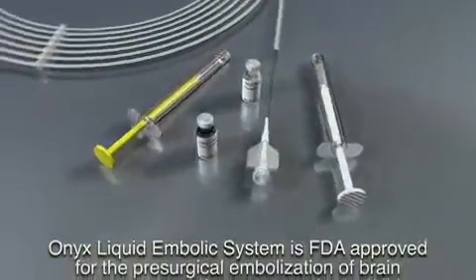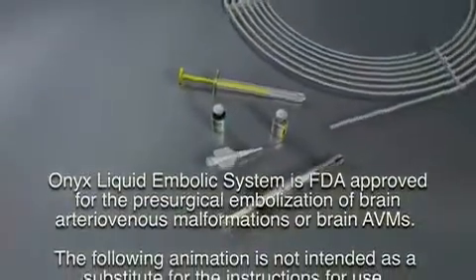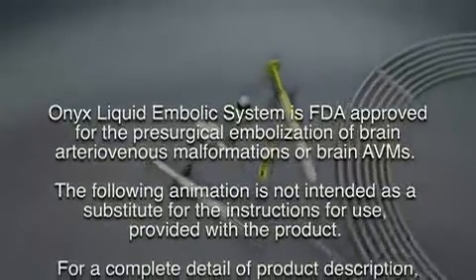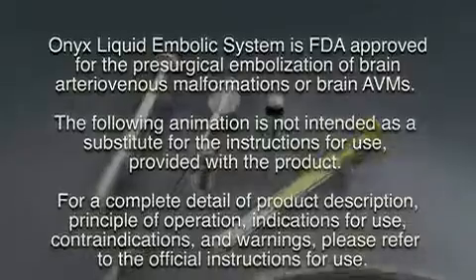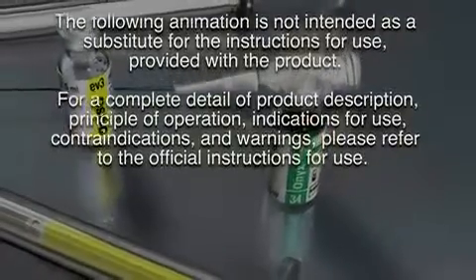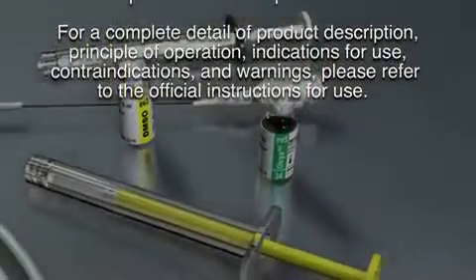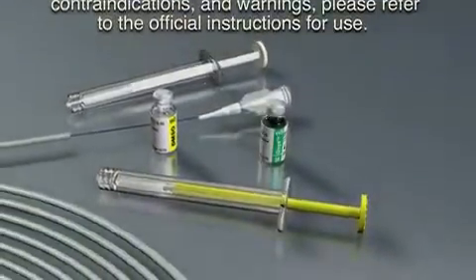Onyx Liquid Embolic System is FDA approved for the presurgical embolization of brain arteriovenous malformations, or brain AVMs. The following animation is not intended as a substitute for the instructions for use provided with the product. For complete detail of product description, principle of operation, indications for use, contraindications, and warnings, please refer to the official instructions for use.